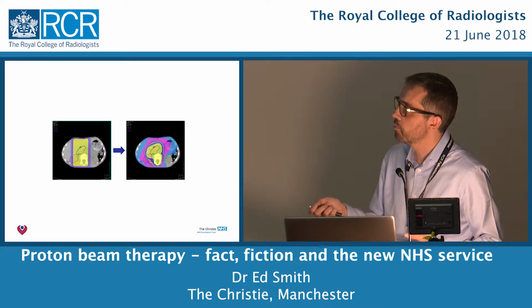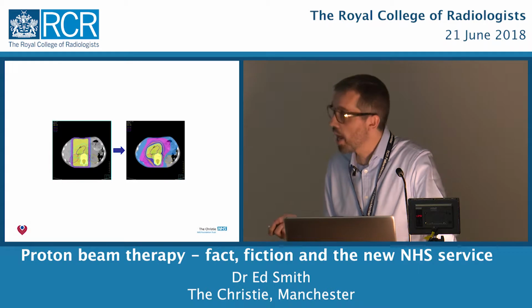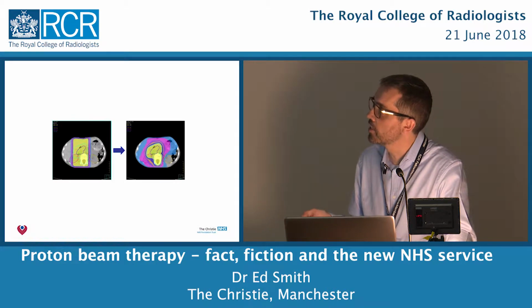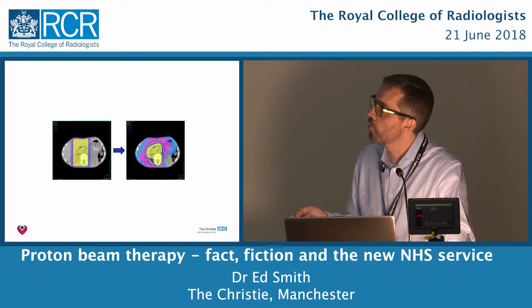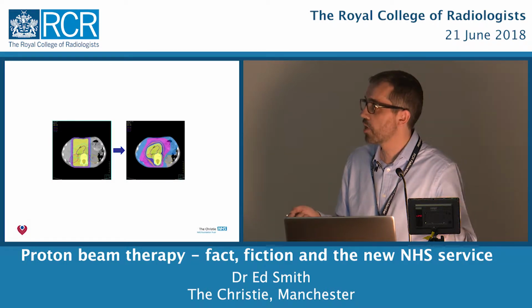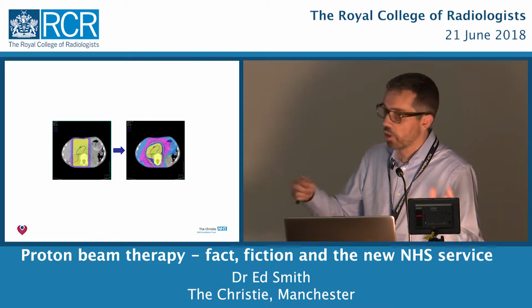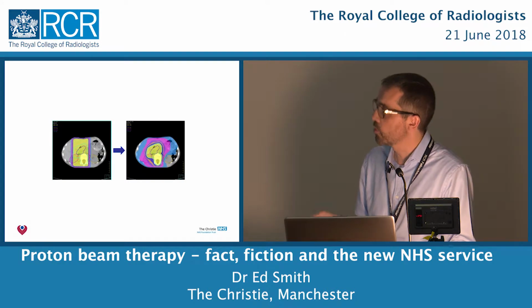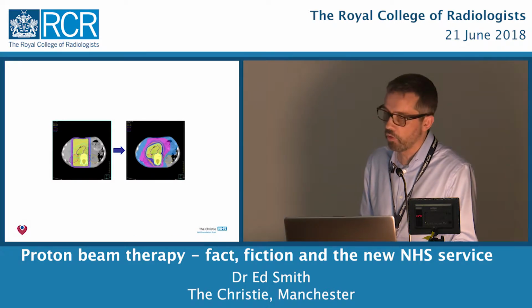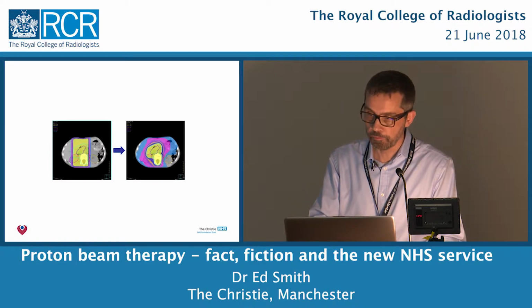What I'm showing here is a tumour in the abdomen of a young child, and the standard approach historically would have been a parallel pair. So essentially you're irradiating a tract of tissue which, yes, contains the tumour, which is here, but is also irradiating much more than that. With advances in technology, intensity modulated radiotherapy and volumetric arc radiotherapy, for example, we're able to conform the dose much closer around the tumour, but that has generally led to this low dose wash in the rest of the body. So that's where we are with X-rays.